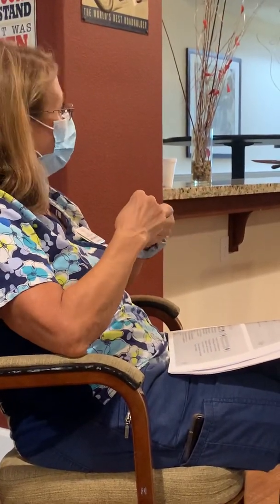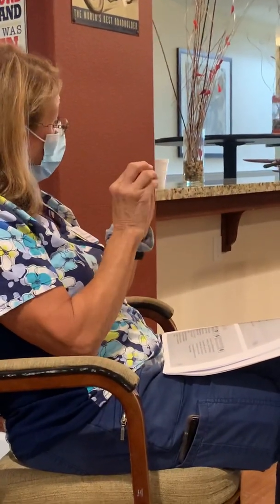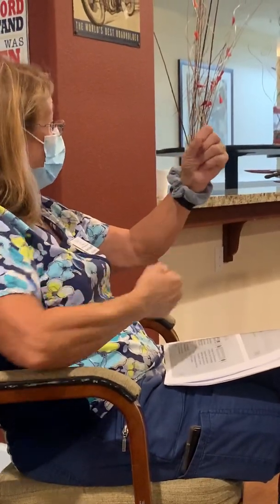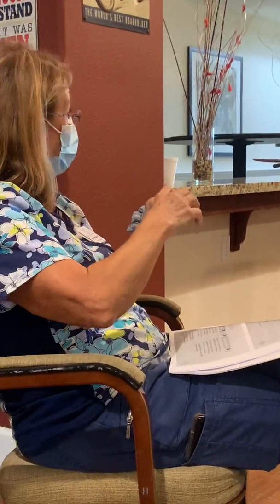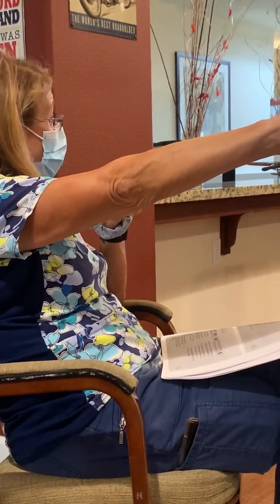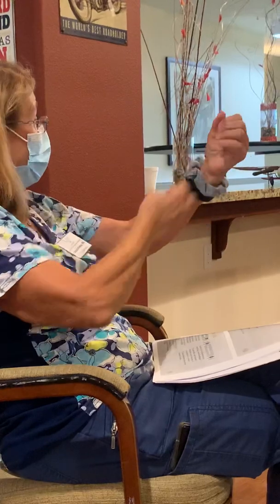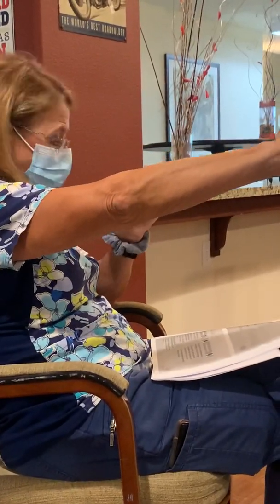When you clean it, you're going to clean from the tip of the penis, starting at the urethral meatus, and then work down in a circular motion, down and away from the tube. And then when you go to clean him, you're going to clean from the tip of the penis back towards his body. Okay? So you're actually going to do two cleanings: the catheter tube first and down, and then from him and back up towards him.